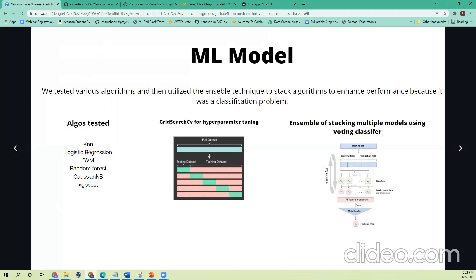Each of the three models gave their predictions, and the outputs were then passed to a voting classifier. The method used for the voting classifier is soft voting — it gets the probability from each model, and whichever label has the highest probability is taken as the final prediction. With this understanding of the model, we move ahead to the deployment.